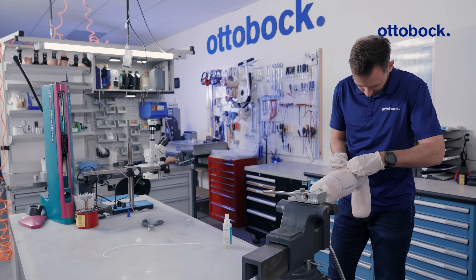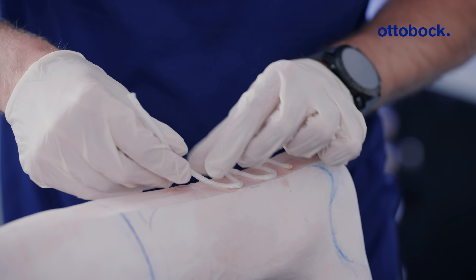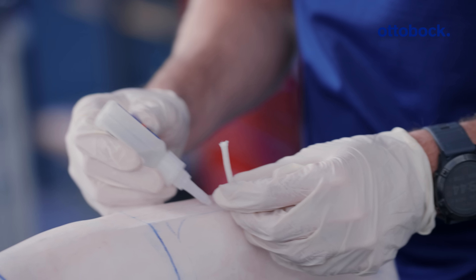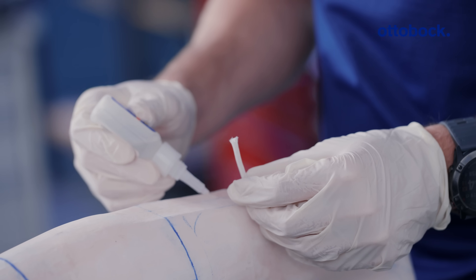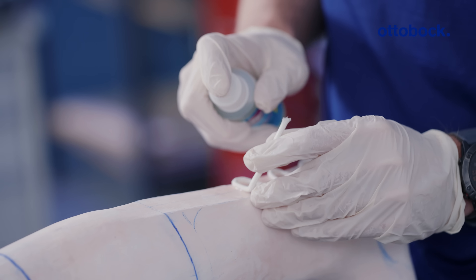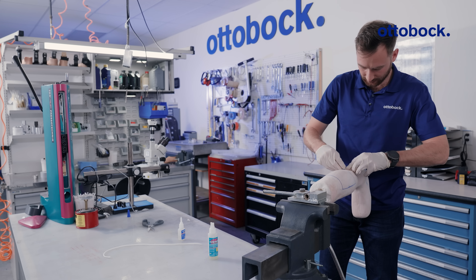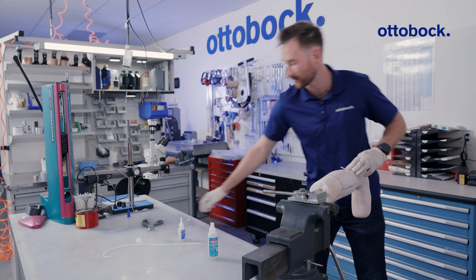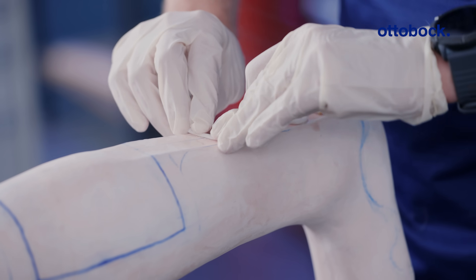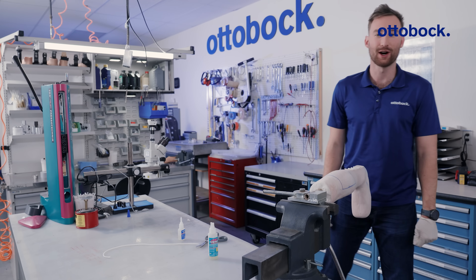We're getting close, just over halfway there. Now as we make our last mark here with glue, we'll see the nice finished pattern that we have all set to go before we move to thermoforming the device. We have a little excess here, so I'm going to take my scissors and trim that off. And we're good to go.